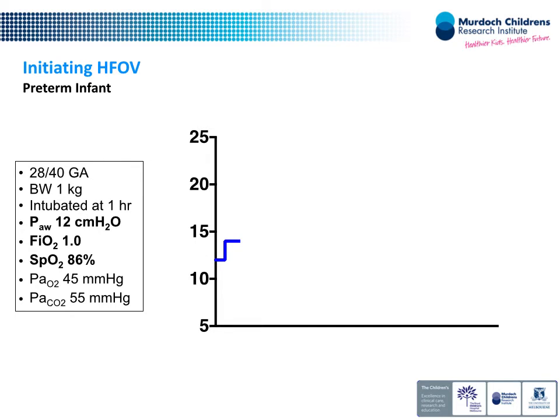I think that's important. Let's assume the baby had the X-ray we saw before. I was just going to say, wouldn't you be concerned about putting the baby on the oscillator prior to giving surfactant? That's an excellent question, and we'll come back to that one after.